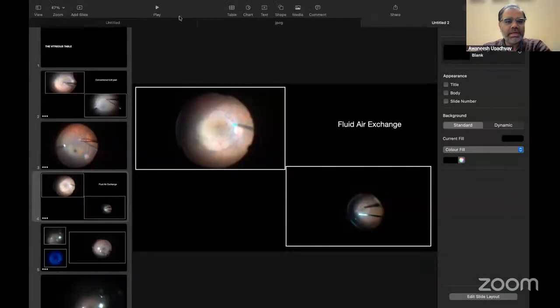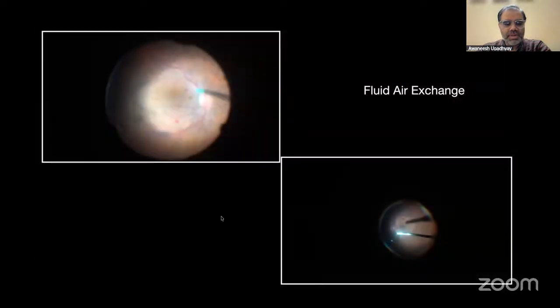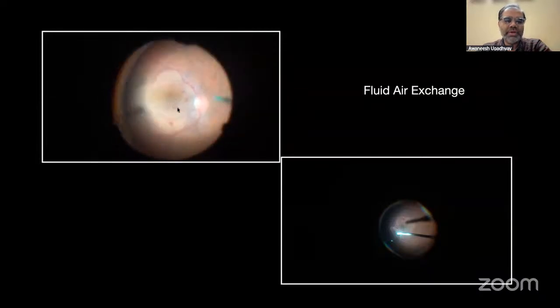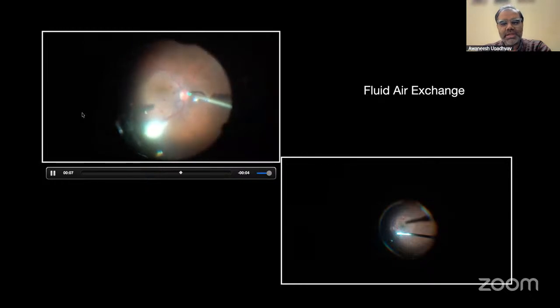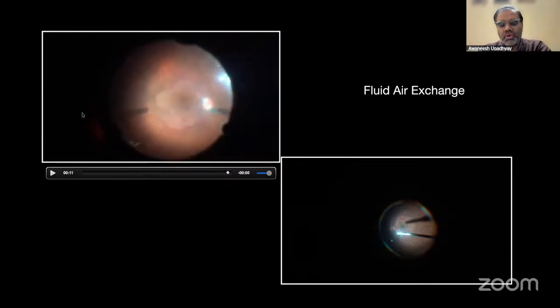Okay, Avnish, I think most of the points Dr. Mohit has covered, but still there are some things which I would want to discuss, which people should be aware about. Yeah, if my slides are visible. So I think Dr. Mohit has actually talked about how you do a fluid-air exchange where you go in directly, and that initial active suction is required, and then once you complete it, you do it bone dry. This is what I prefer.